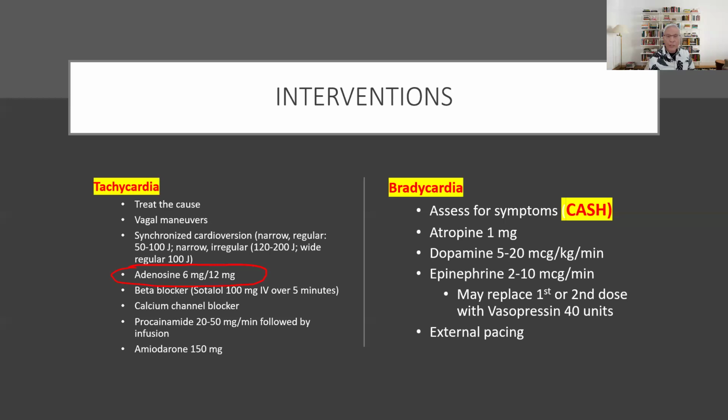the heart rate. And lastly, if you're not going to respond to any of these, we might as well give you a zap. And the zap that I'm talking about is what is known as cardioversion. And there's a difference between cardioversion and defibrillation, which we will be discussing in a little bit.